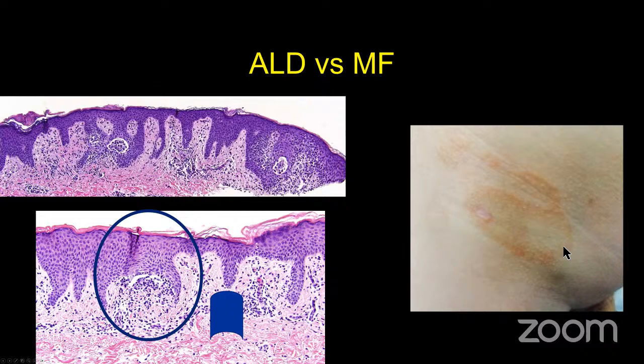With this nice annular lesion, some people think it is difficult to differentiate this from mycosis fungoides because of the annular nature on the girdle area, but they are usually kids, and the lymphocytes don't have atypia, and it's polyclonal.